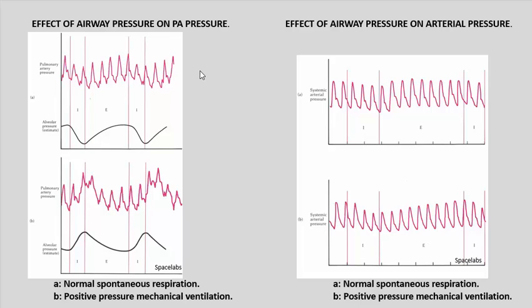It turns out now with more recent studies that it's probably more accurate to record the mean of all of those values, systole, diastole, and mean. For years, I had so much difficulty trying to isolate those values that I simply ignored the recommendations and put down my own values. And of course, many of the senior cardiologists ignored my values, got their calipers, and measured what they thought should be the true values.